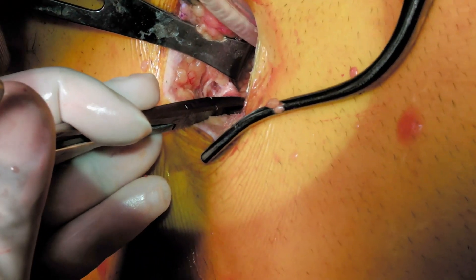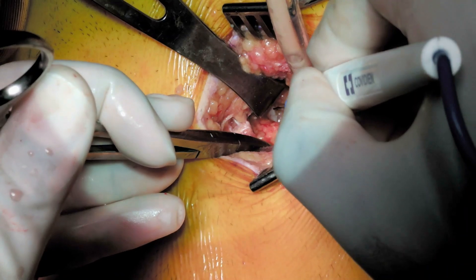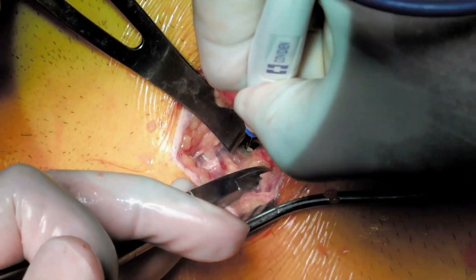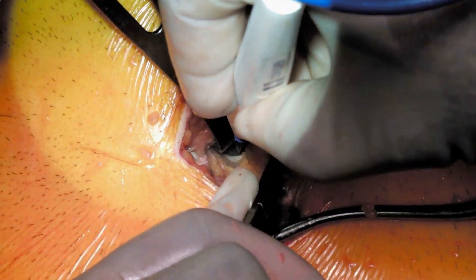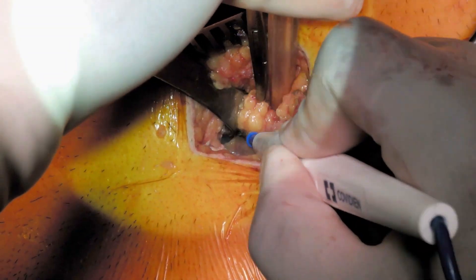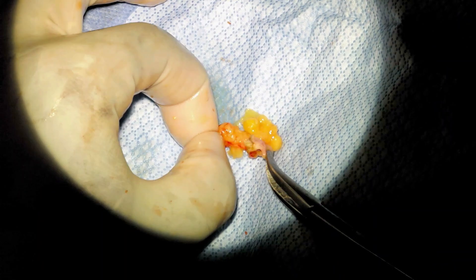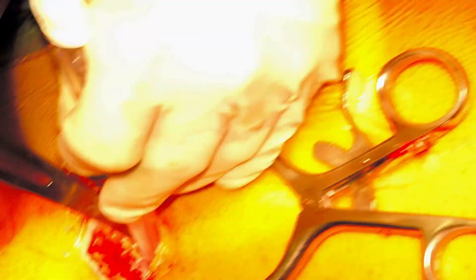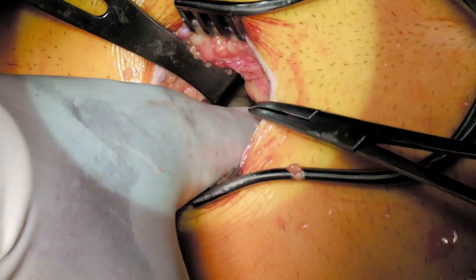I'm further opening up the pericardial window, removing pericardium so the hole is as wide as possible. I'm taking out more tissue — some of that is fat — and separating the fat from the pericardium. I'll send that pericardial tissue to be assessed by pathology.